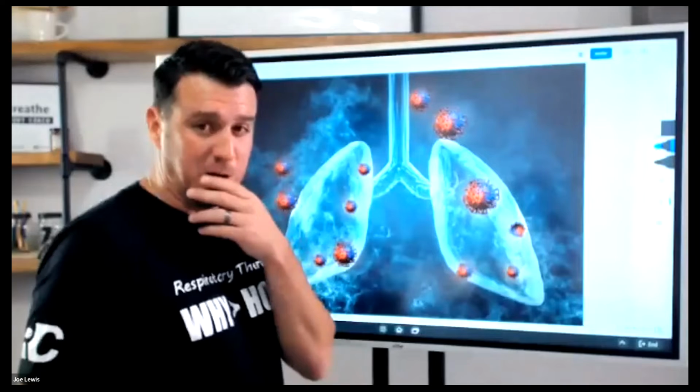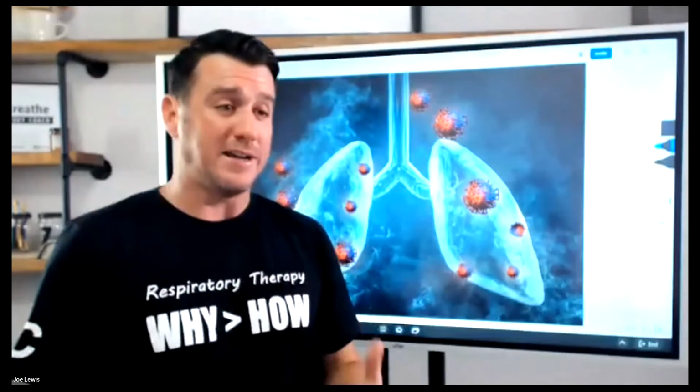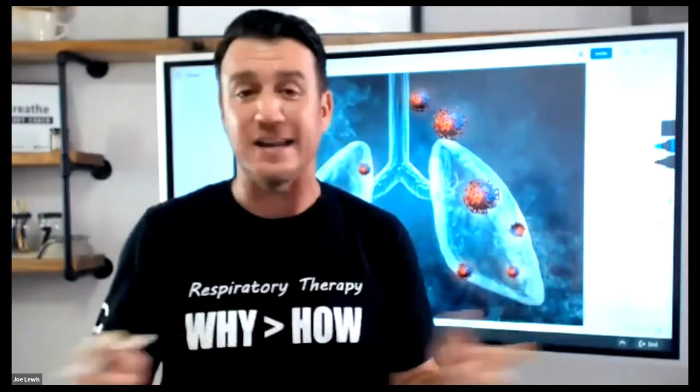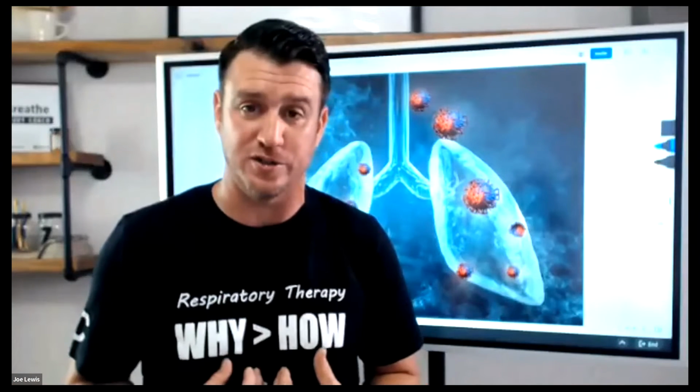And this one I think is the most interesting to me, because what we recognize is that when we put somebody on mechanical ventilation, we are implementing a process that does not mimic normal natural breathing. We are not positive pressure breathing humans. We breathe off of negative pressure.